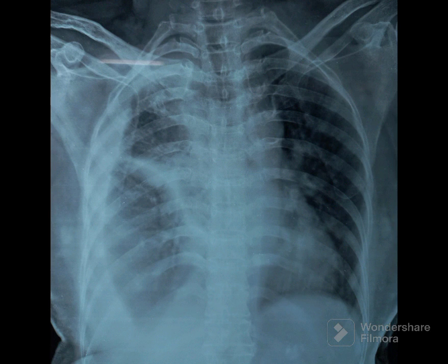There is a homogeneous opacity in the lateral aspect of the right hemithorax which extends around and encases the right lung. There is diffuse haziness in the right lung. In the right mid-zone it appears as if fluid is tracking along the fissure, or an alternate opinion could be there is fissure thickening. The CP angle is blunted.